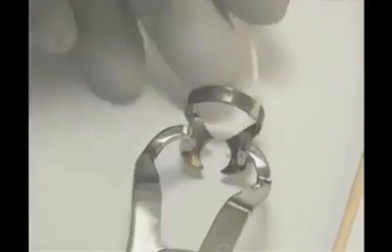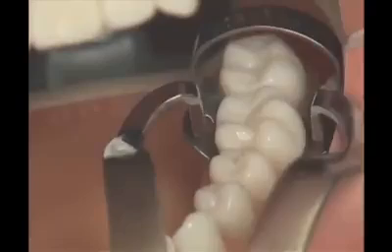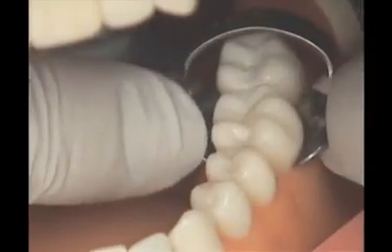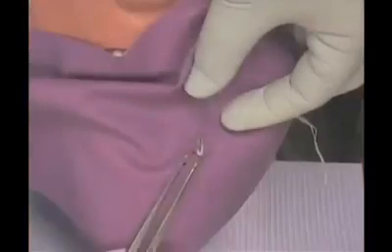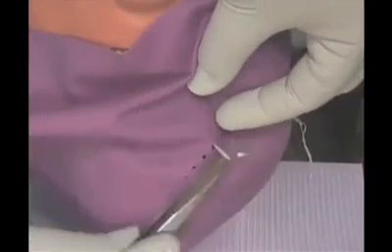Select the correct size of clamp. Secure the clamp by tying a ligature of dental tape on the bow of the clamp. Place the beaks of the rubber dam forceps into the holes of the clamp. Position the lingual jaws of the clamp first, then the facial jaws. Following placement, check to see if the clamp is stabilized on the tooth and check for fit. Use cotton pliers to retrieve the ligature so that it is exposed and easy to grasp if necessary.